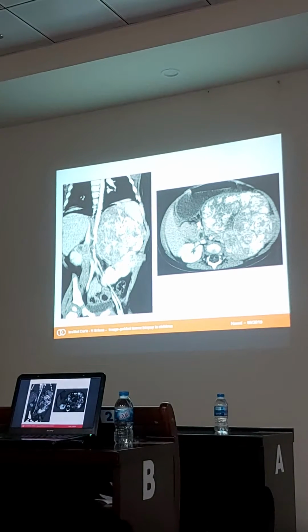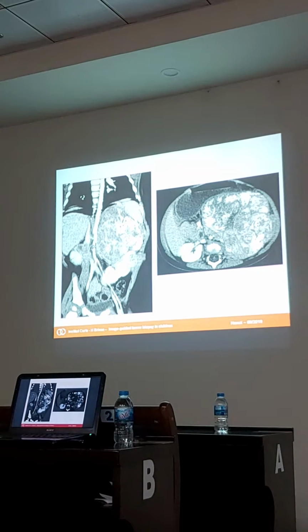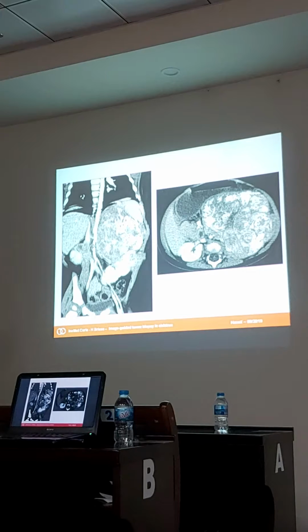You can get, of course, the diagnosis of neuroblastoma with other methods. You have the MIBG scan, you have the biological markers, but you will need the biopsy to first confirm the diagnosis, but mainly to get the genetical information, which are very important for the prognostic and to decide the appropriate treatment. So we will go to a biopsy for this kind of tumor.